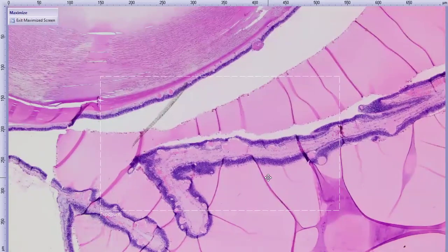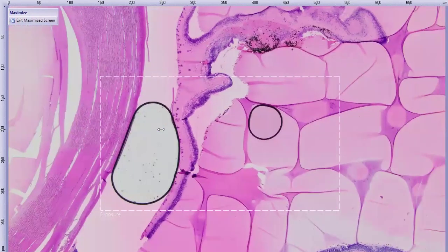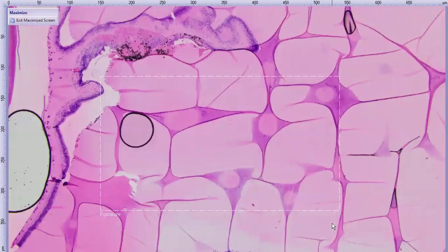And you can see that proteinaceous exudate in the subretinal space, and it's kind of semantics now, right? Because the vitreous is in front of the retina. If everything is collapsed and the retina is plastered against the lens, then the vitreous is just that right there, right? Everything else is subretinal space. But it got that proteinaceous exudate.